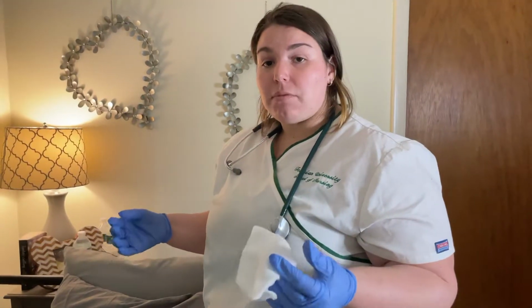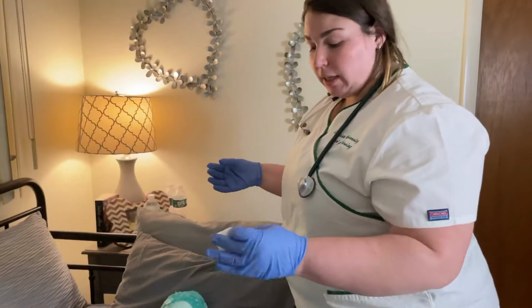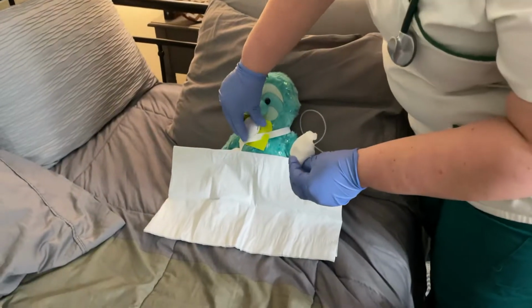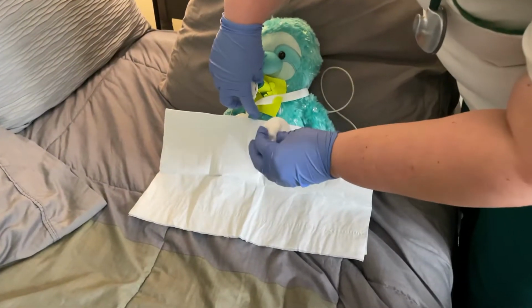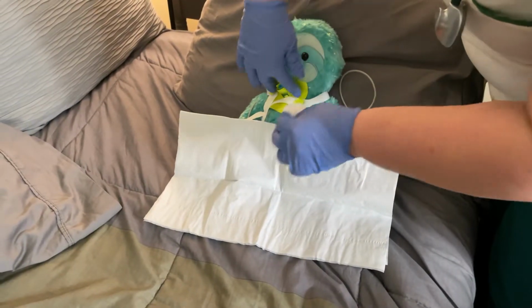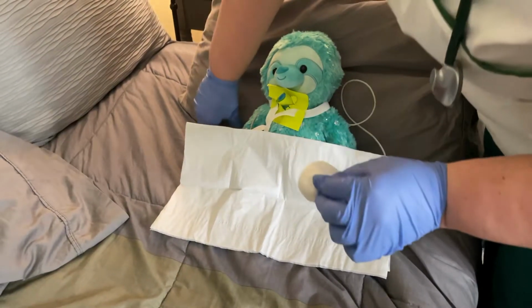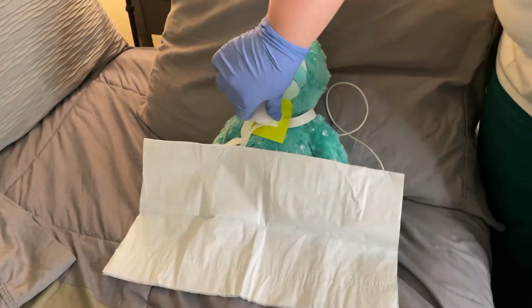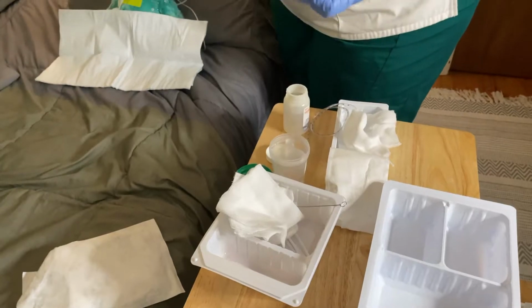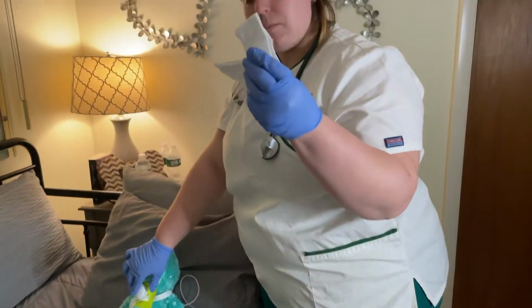Always making sure to put oxygen on the patient if needed at any point during the cleaning process or the suctioning process. Remove it. We're just going to dab it with a 4x4, securing the faceplate and dabbing the top. Put the oxygen back on. The last thing we're going to do is we're going to grab our pre-perforated or pre-dressing.